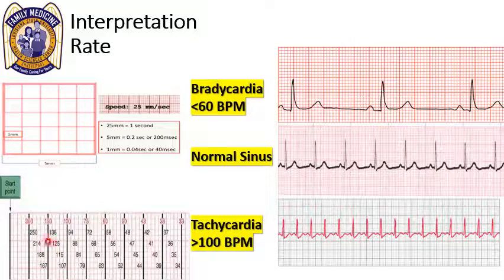Now obviously these secondary numbers are very good to know about, but usually if you know you're in a range of 300 to 150, then we're in SVT range. 150 to 100, we're in the tachycardia range, and then 100 to 60, we're in the normal sinus range, and then 60 and below, we're in the sinus bradycardia range. So breaking it up into parts and knowing that, if I only jump once, we have a problem. Those are really important to help you diagnose and treat things.